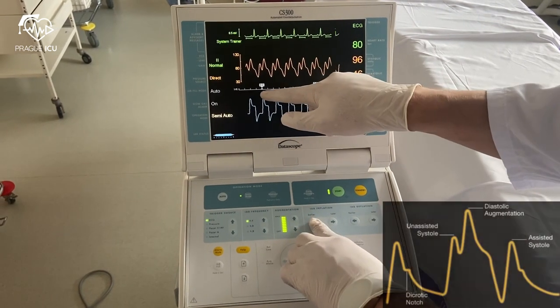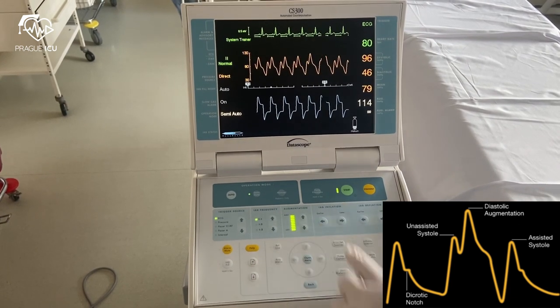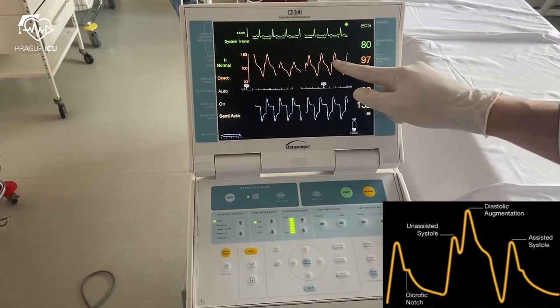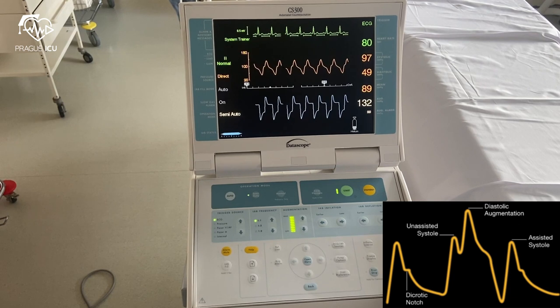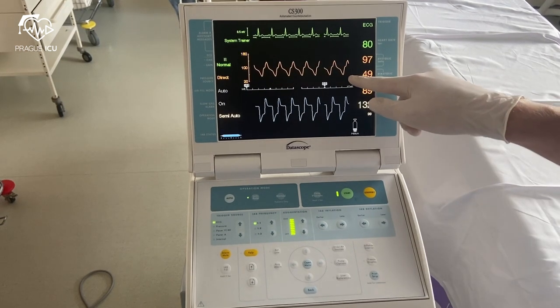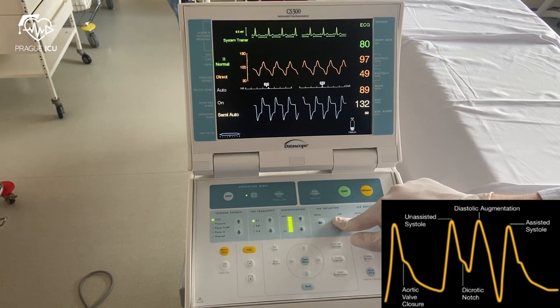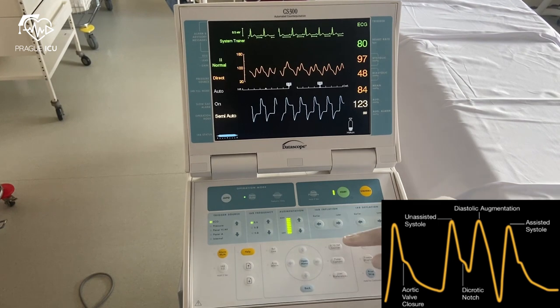In case of early inflation, the balloon pump inflates prior to aortic valve closure. Inflation of the balloon appears prior to the dicrotic notch and diastolic augmentation encroaches onto the systole. In case of late inflation, the balloon inflates markedly after closure of the aortic valve, after the dicrotic notch.